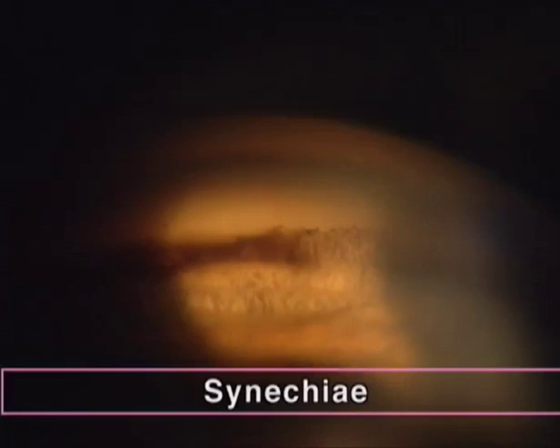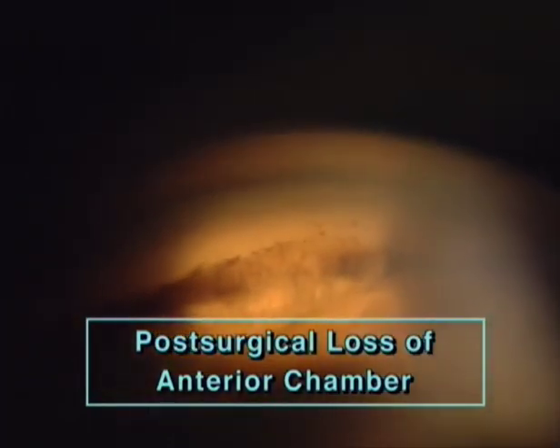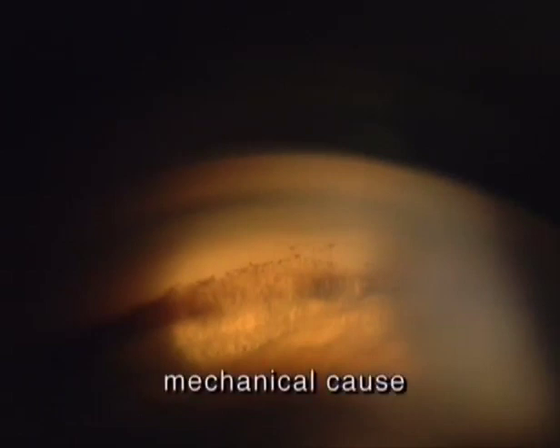Synechiae. Synechiae do not respect anatomical boundaries, as shown here encased years after post-surgical loss of the anterior chamber. The adherence of the iris stroma is not confined to the angle, but extends far into the cornea. Note that only the very superficial tissue is adherent. The stromal pattern has remained normal without any distortion, and this is a picture indicating a mechanical cause for the synechia.